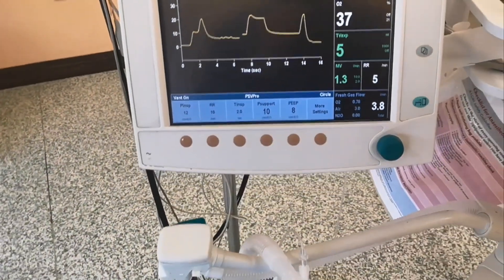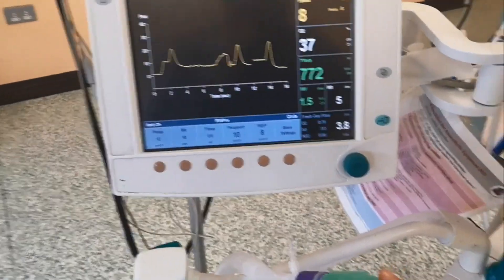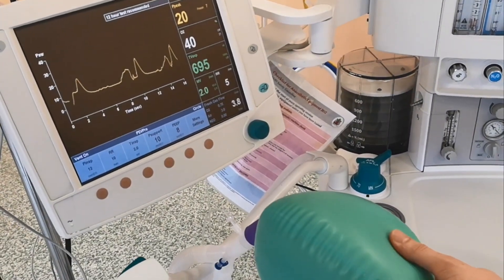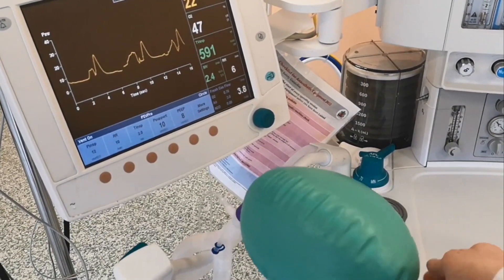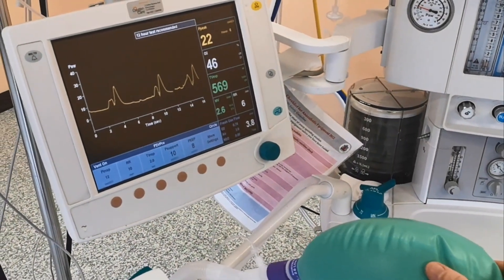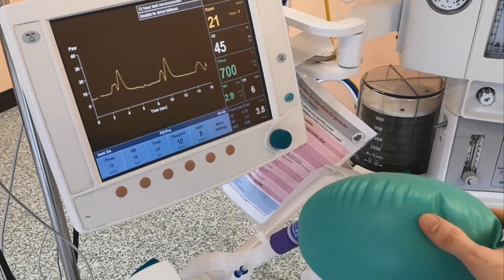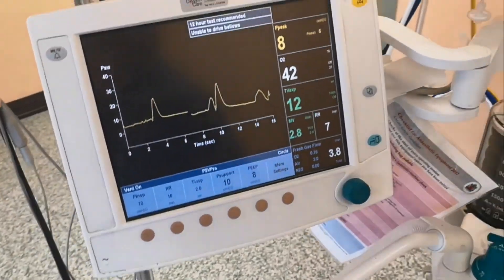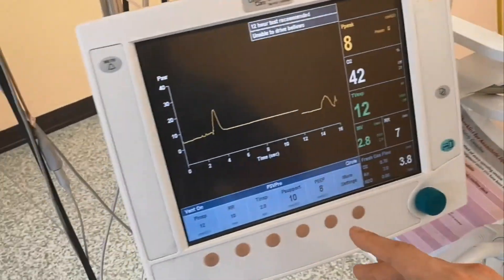If the patient is making efforts — I'm moving the bag here — you can see that the machine delivers an amount of pressure every time the patient tries to breathe. There is a sensor here that senses the change of flow, detects that the patient is trying to breathe, and then delivers a breath.